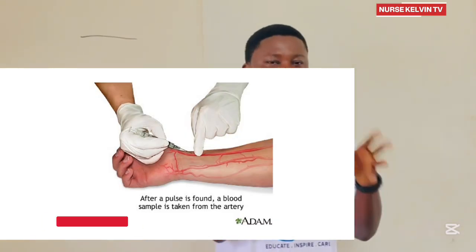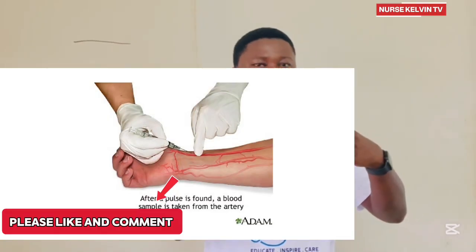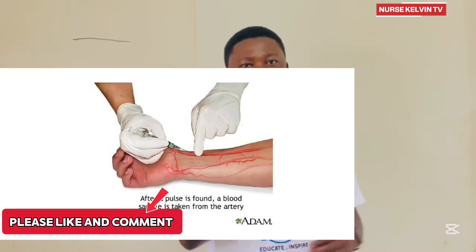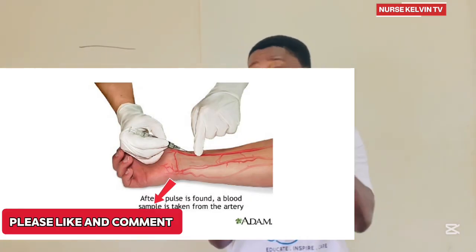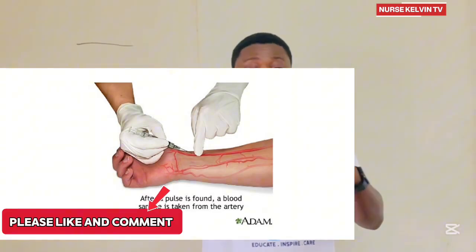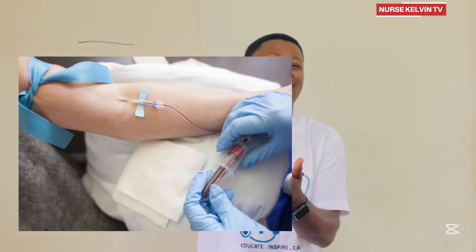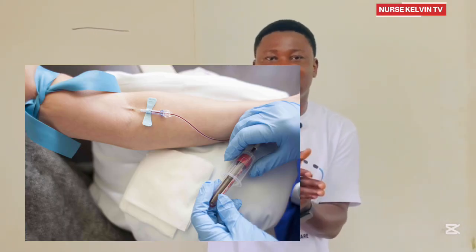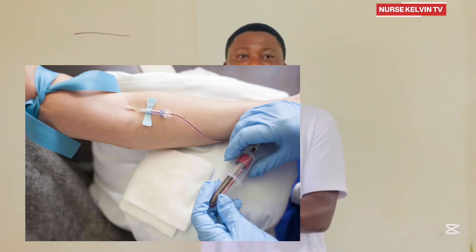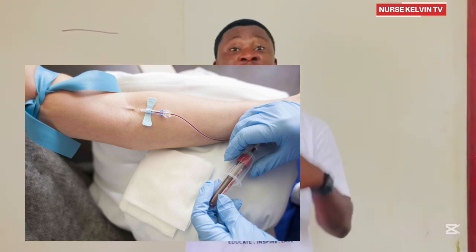If you've learned about acid-base balance in medical crisis 1, this is something you need to know about the arterial blood gas. So this device helps measure the amount of oxygen and carbon dioxide in the blood, and it also monitors the blood pH. That's the use of this machine.